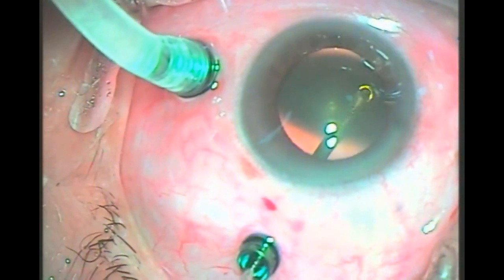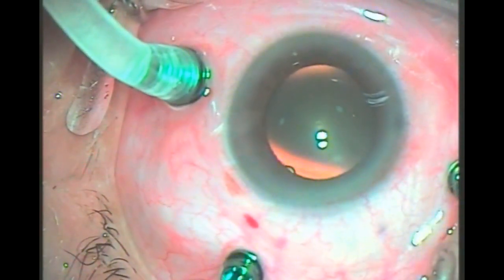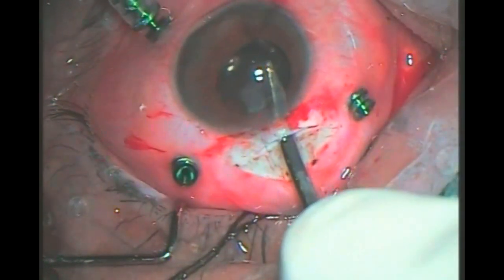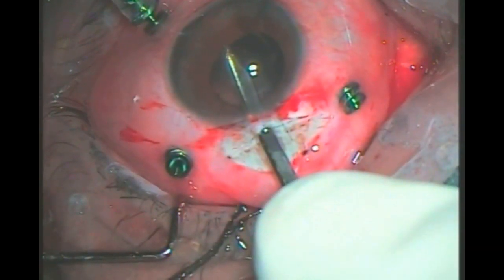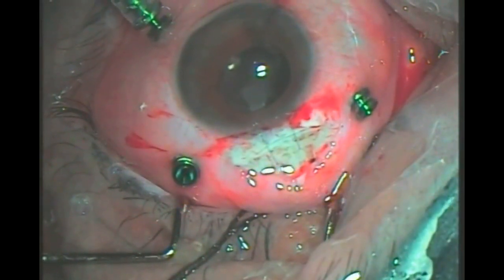Too much anterior vitrectomy can lead to intraoperative lens opacification by inadvertently touching the posterior lens capsule with the cutter tip, which can seriously hinder the visibility of the posterior pole. This often warrants removal of the crystalline lens by pars plana lensectomy.